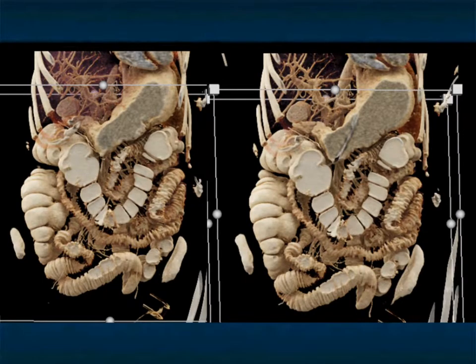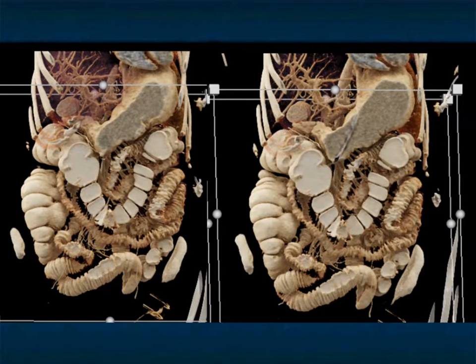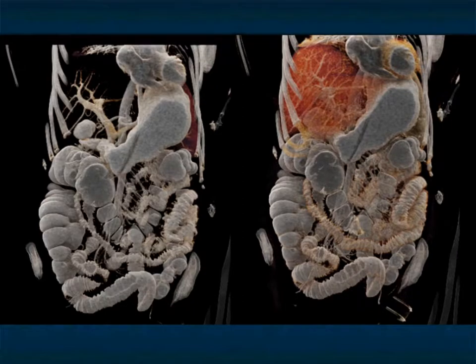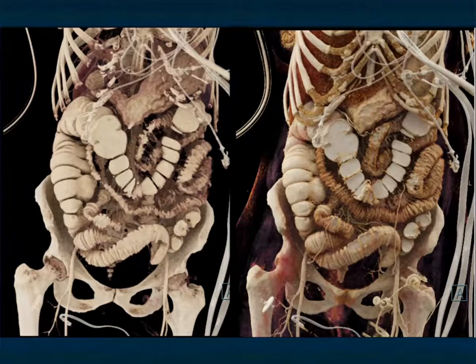But look at the cinematic. Look how nicely we can use the positive contrast as a marker for looking at fold thickening, looking at the Haustral folds of the colon, and the thickening of the small bowel folds, in addition to looking at the stomach. You can think about how we can display this through a range of perspectives and optimize the visualization of bowel — perhaps a dedicated cinematic rendering small bowel or large bowel exam.